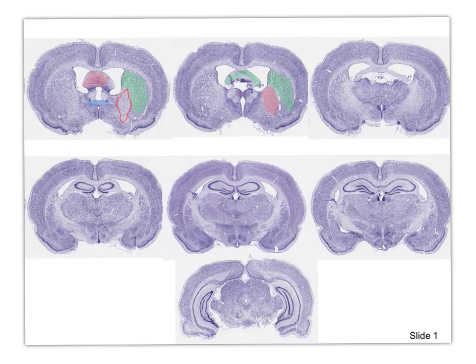All right, so moving to the next slide, we've got caudate. And this is GPE, by the way, that we're talking about. This is globus pallidus, and this is the main difference that I want to talk about. And then this is probably right here, ventrolateral nucleus of the thalamus.